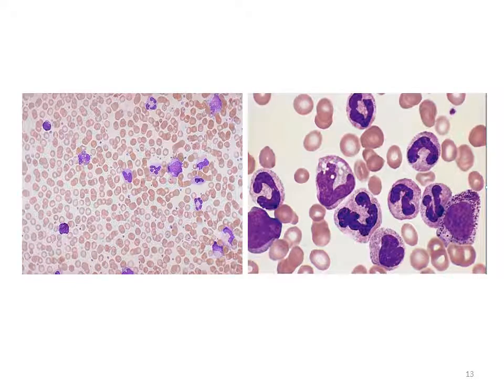Under the high power or 100-power objective, confirm immature white blood cells by moving from low or mid to high power. High power allows you to identify the details and classify each white blood cell, as evidenced by the slide to the right.